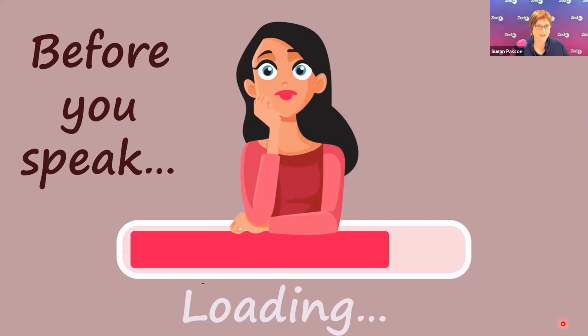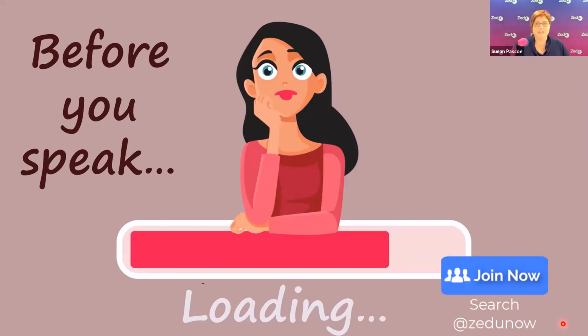So I will say to the patient, I might not get all the information that we need today, especially if they're at that 6 weeks mark. Before they lie down and before the probe goes on the tummy, I already sort of prepare them. If we're expecting it to be 6 weeks, I may not have an answer for you today. That starts that conversation if we're in that grey zone and we can't get the answer, or it helps me explain why I need to do a transvaginal scan.